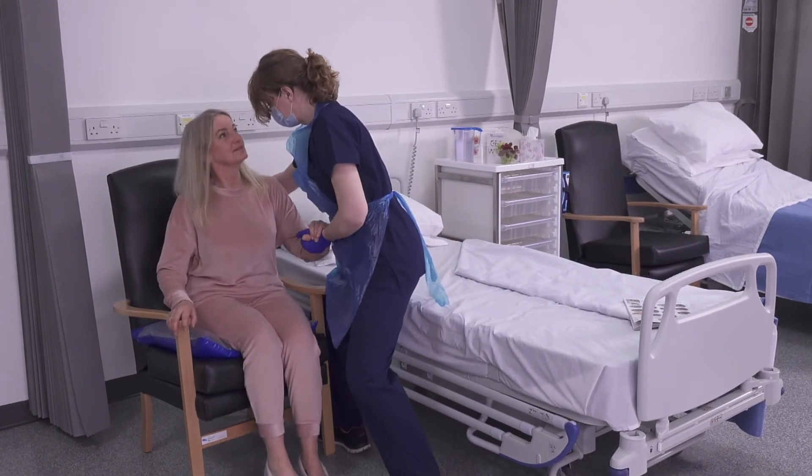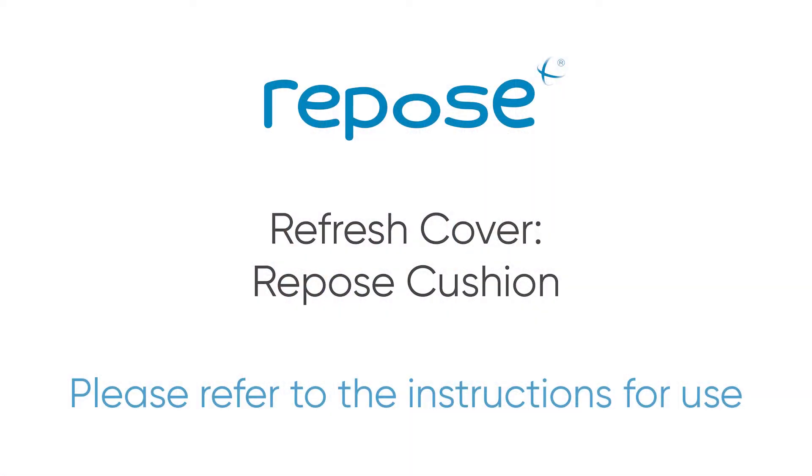The Repose Cushion is now ready for use. For further information, please refer to the instructions for use or visit the Frontier Medical Group website.